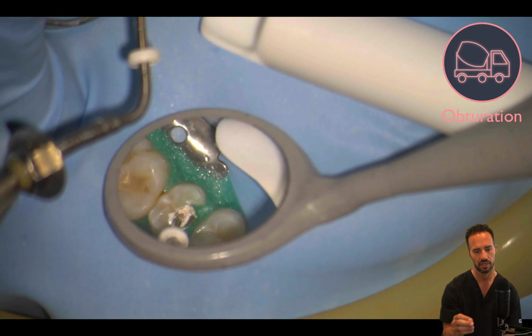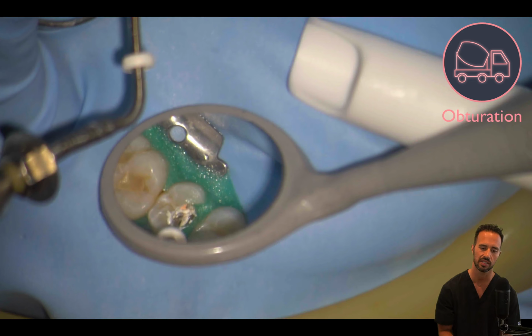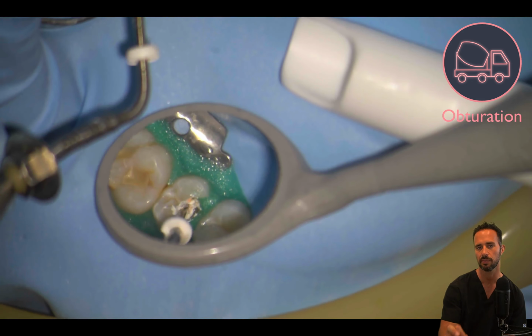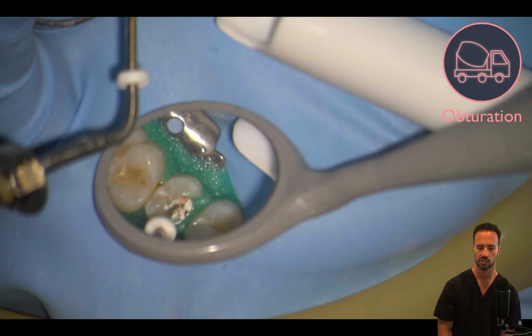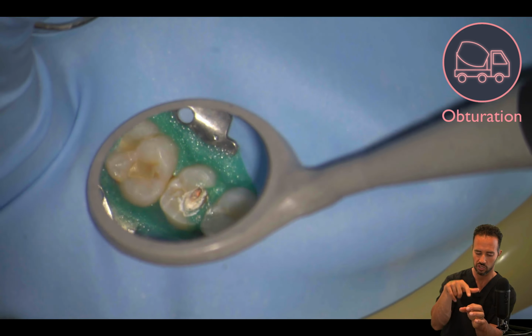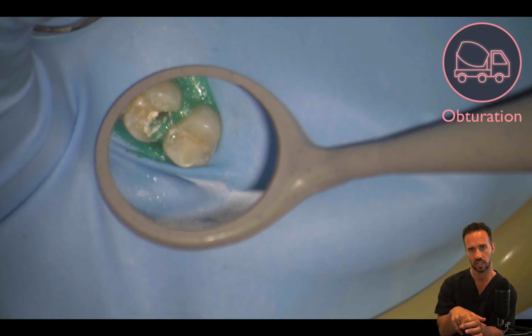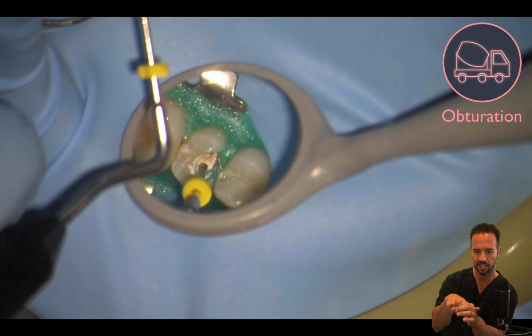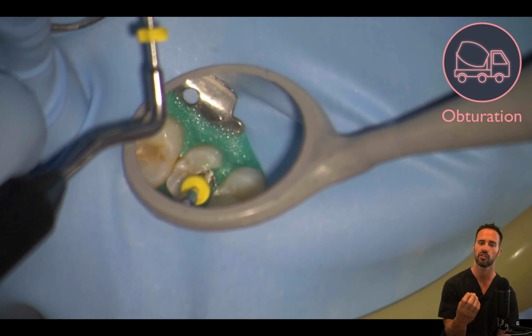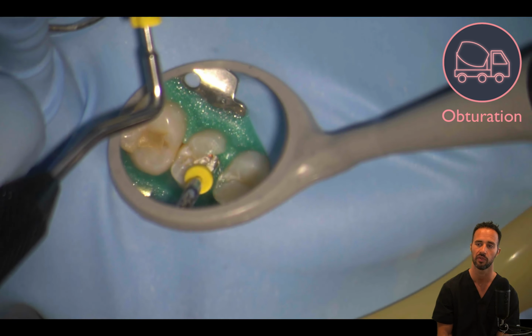Sometimes I go in with the System B tip in order to clean up the excess, and I'm actually using that same System B tip to leave the post space in the palatal canal. So I like to essentially activate the heat, insert to the appropriate length for your post space, let it cool for 3 seconds, and then activate the heat and pull out in order to remove the gutta percha that's in that post space that you're trying to remove.